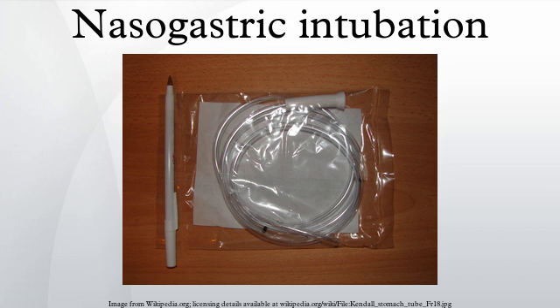Types of nasogastric tubes include: Levine catheter, which is a single-lumen, small-bore NG tube. It is more appropriate for administration of medication or nutrition. Salem sump catheter, which is a large-bore NG tube with double lumen. This allows aspiration in one lumen, and venting in the other to reduce negative pressure and prevent gastric mucosa from being drawn into the catheter.